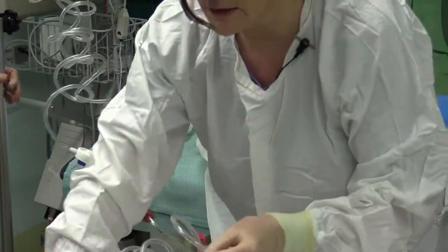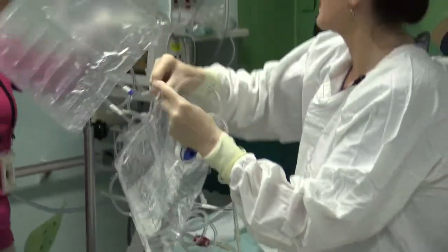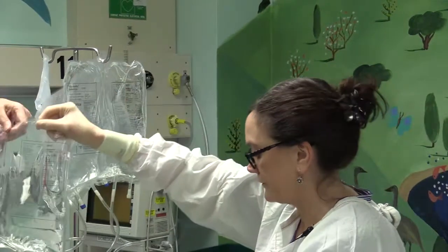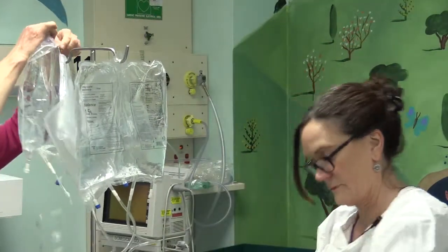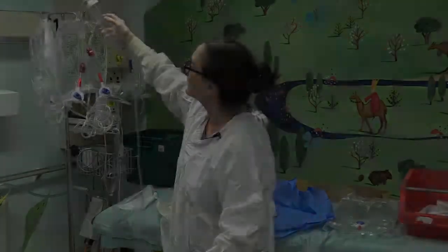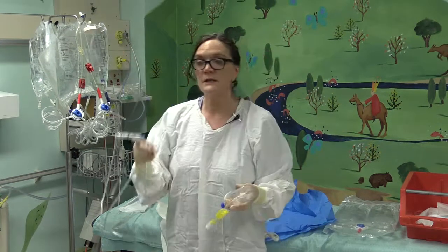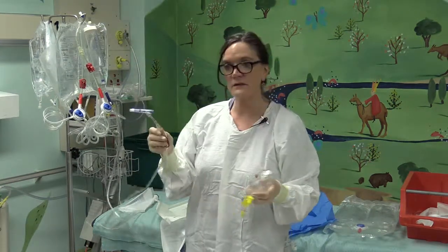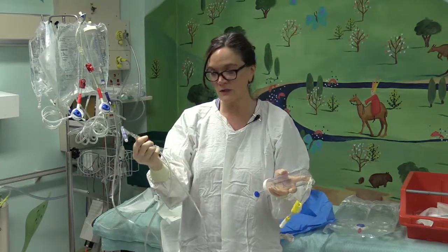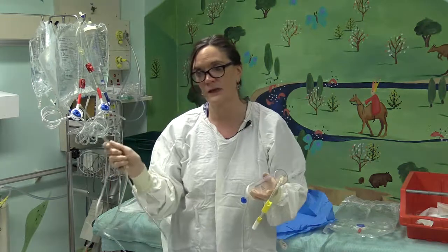and hand the bags to my assistant. I'll hang that over the pole without touching. It's important when you're hanging the bags to make sure that the piece of tubing that goes to the patient doesn't hit the floor. So just make sure that you're hanging on to that at all times.